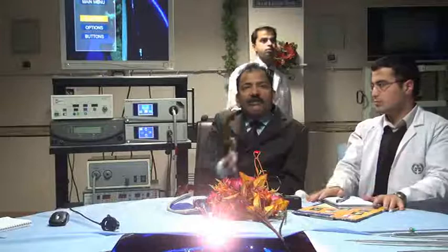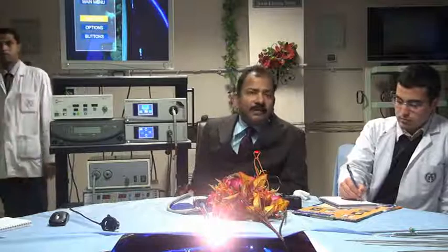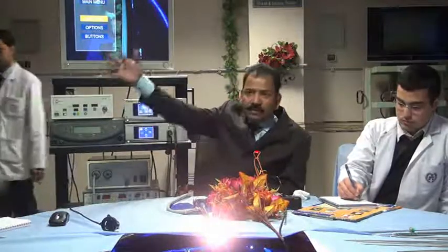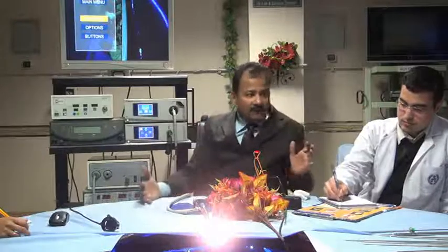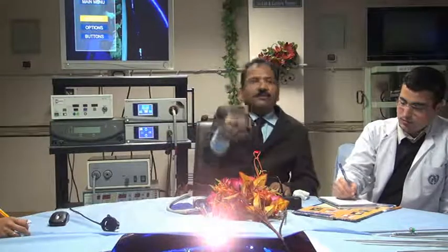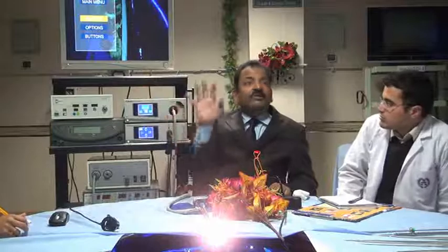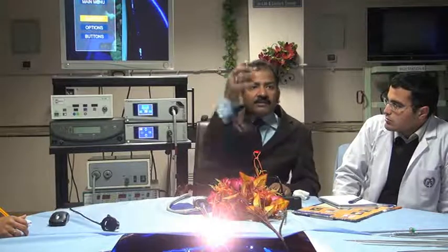Closing the light. It is the amount of time you are allowing the light to go to the lens. In old times, in black and white movies like Charlie Chaplin, you might have seen the actress coming for her photograph, there was a black camera covered by black cloth, and they were putting a cap there. Ready, 1, 2, 3, over. If light is less, they were opening this for a little more time. If light is very bright, the shutter should be opened for a shorter time.